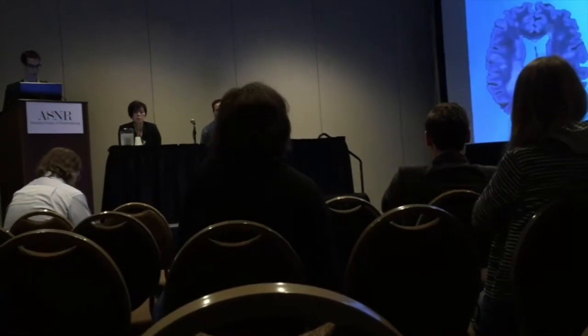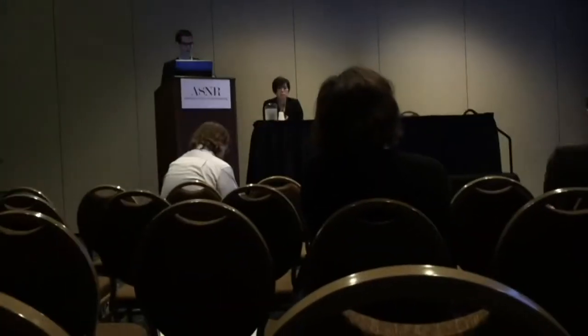To conclude, FLAIR fusion is easy to implement. It's cost-effective because inter-exam fusion is included in all post-processing packages, whereas inter-exam subtraction is not. It provides nicer and easily understandable images for the clinician, and overall it permits working faster and probably detecting a higher number of new lesions. Thank you.